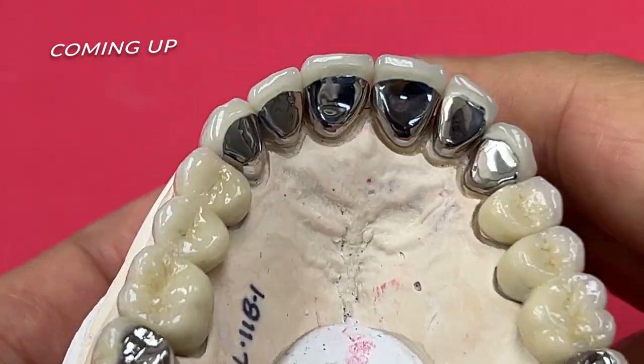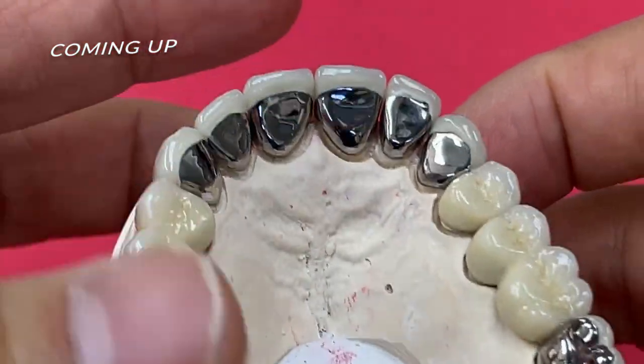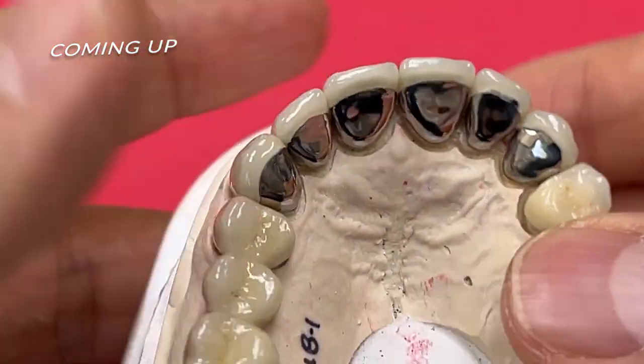Right, this is the finals after glazing and then polishing with the detail, contour and design.